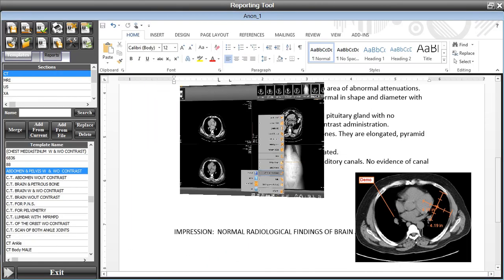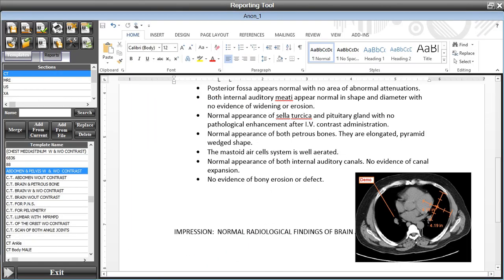The reporting tool provides referring physicians with a final report and relevant images on time, so as not to delay continued patient treatment. The advanced reporting module features voice dictation, structured reporting, and smart templates.